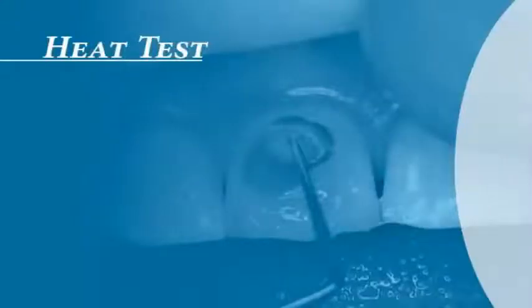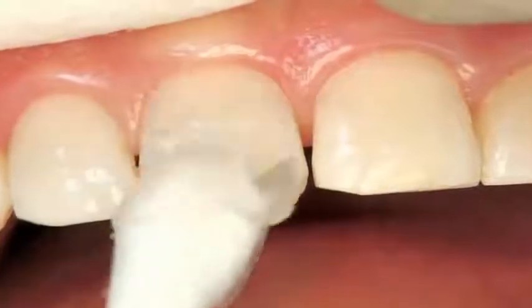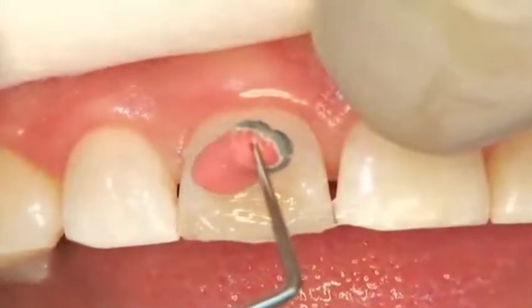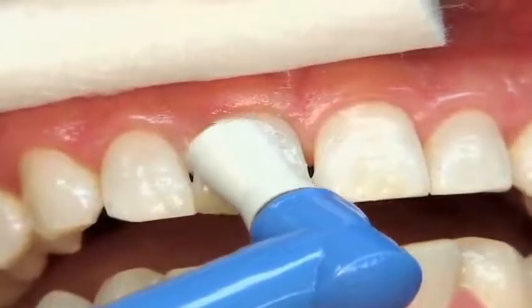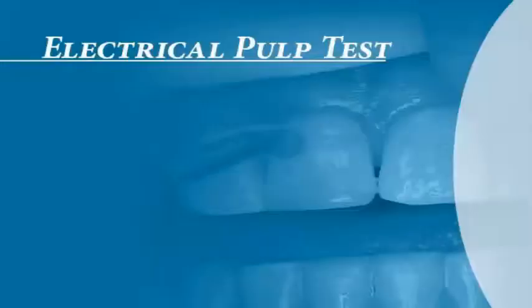Heat tests. After the tooth is isolated with cotton rolls and dried, the tooth surface should be coated with petroleum jelly. Gutta percha heated in a flame is then applied to the facial surface of the tooth for this test. Another technique for heat test is to rotate a dry rubber prophy cup on the surface of a tooth to create frictional heat.